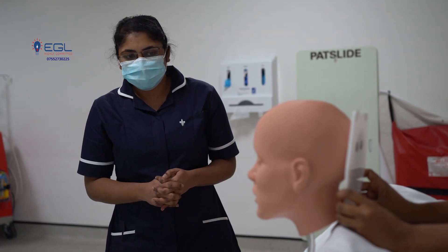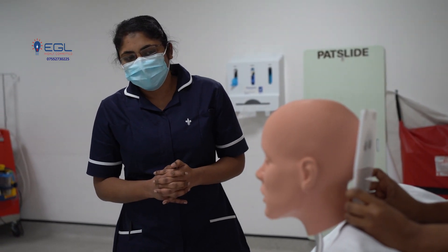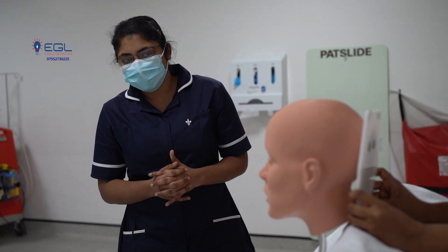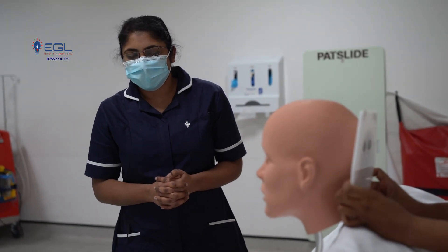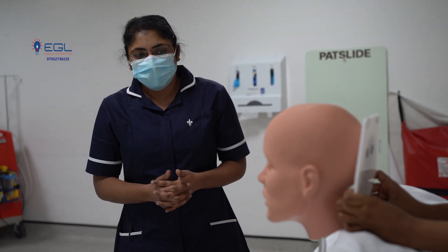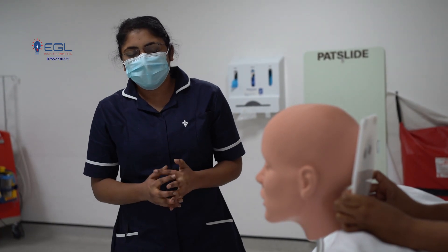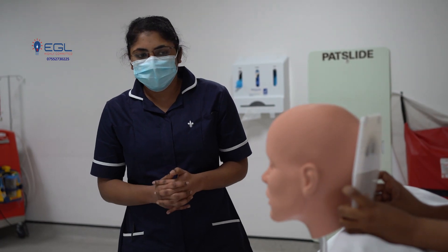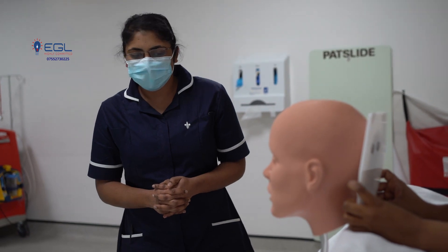Okay, let me explain the procedure. We are going to insert the tube through one of your nostrils. So before that, could you sniff through both nostrils? I can see that both your nostrils are patent. I am happy to insert the tube through either nostril. During the procedure, it is important to be in a sitting or semi-sitting position. You are in a sitting position, so this position is okay. Are you comfortable in this position? Yes.